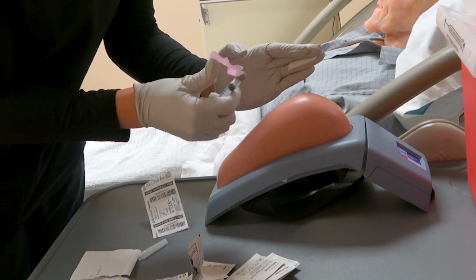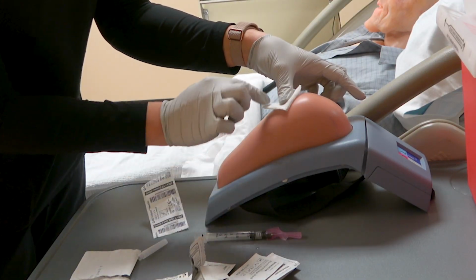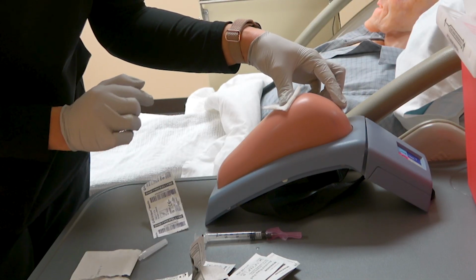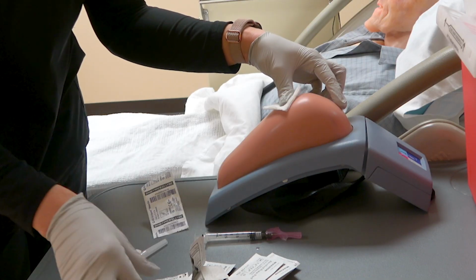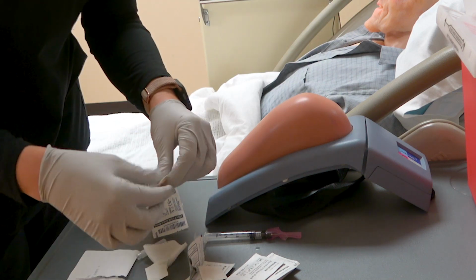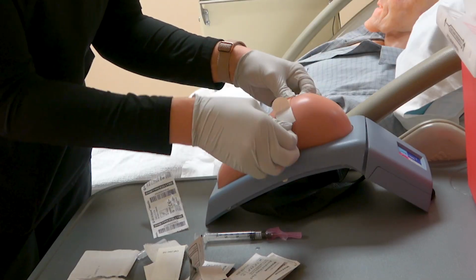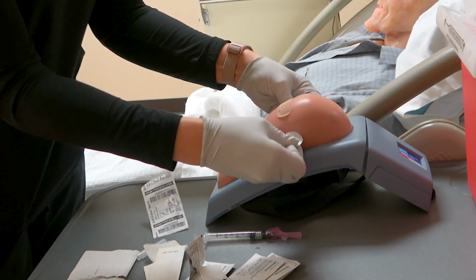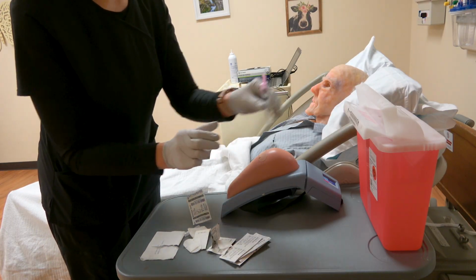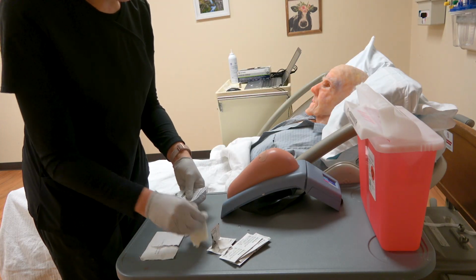We're going to let go. We're going to activate our safety, and we can put our gauze right on top of that injection site, making sure not to massage that area as we can lose some medication. If we need to, then we can put a Band-Aid over that area. And we can clean up our mess here. So we're going to put our needle into the sharps container, and we're going to throw away all of our garbage here.